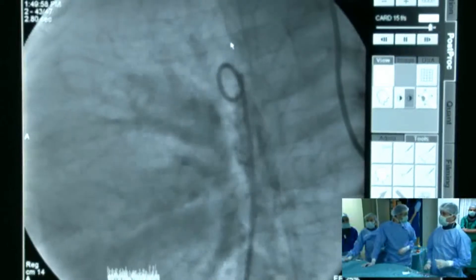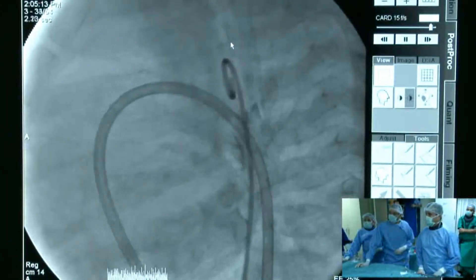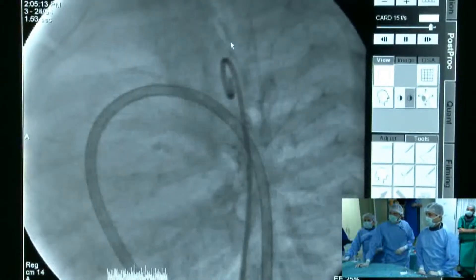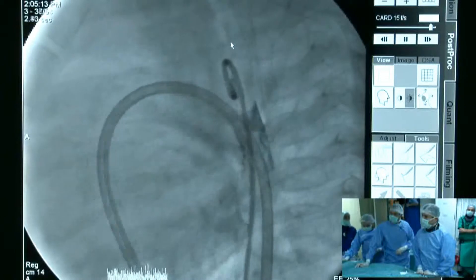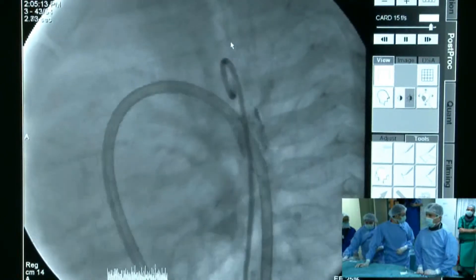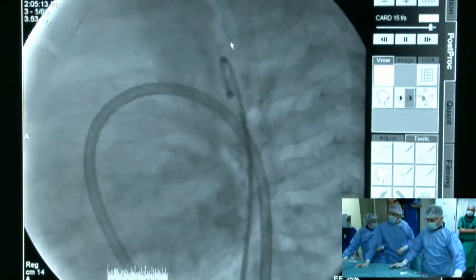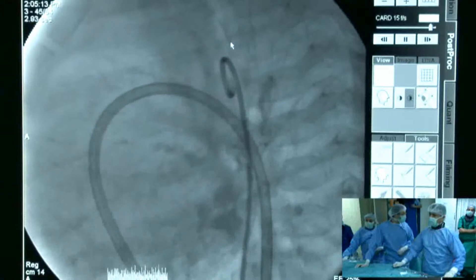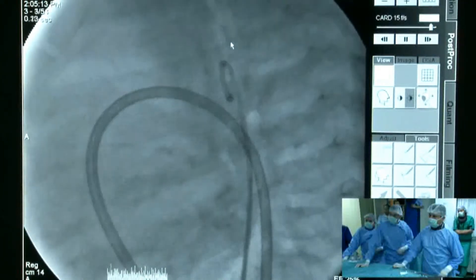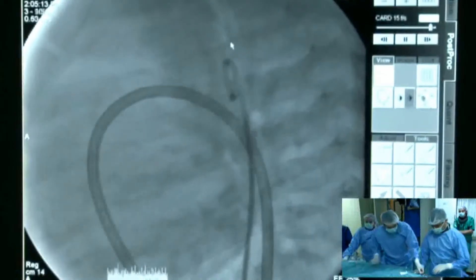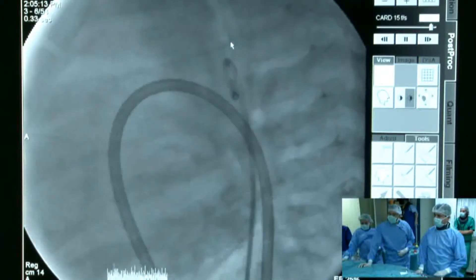We were not satisfied with the initial measurement, so we performed another maneuver — we passed a long sheath into the PDA and then injected contrast. We recognized it almost closed, though there is a residual shunt. The sheath is six French. So if you measured roughly 3 mm diameter using a six French sheath, it cannot be closed by the sheath itself because it is too small, confirming the narrowest part is roughly around 3 mm.